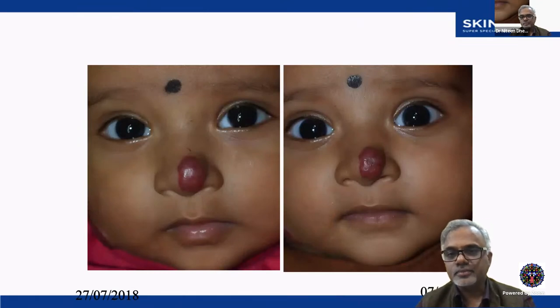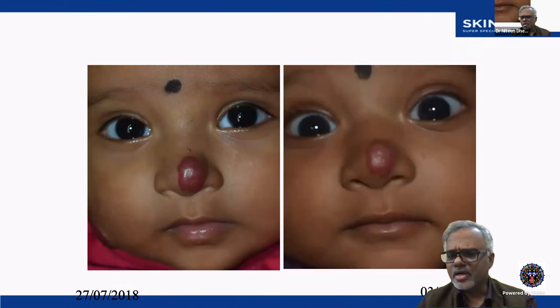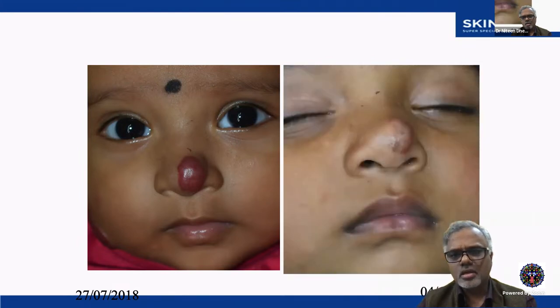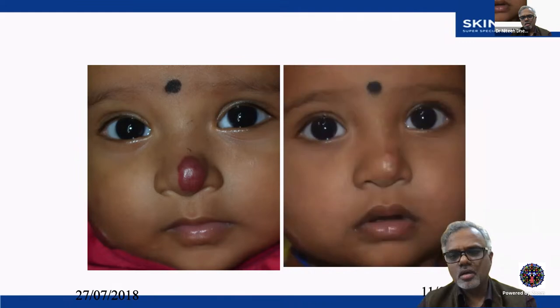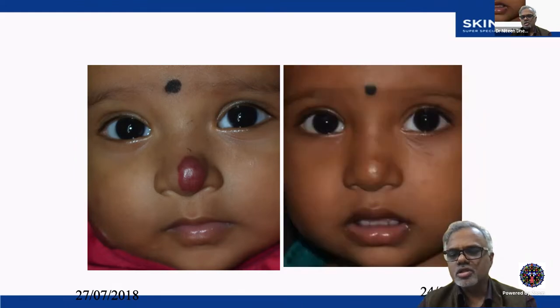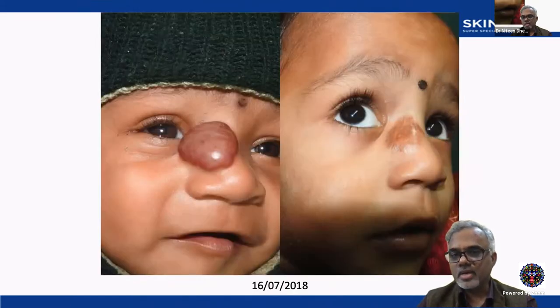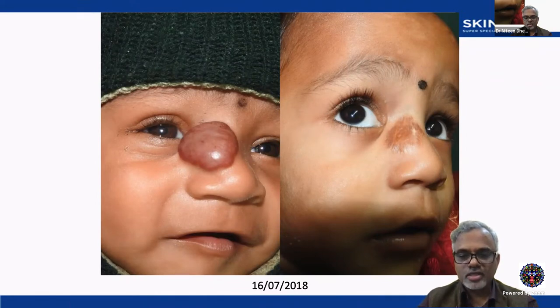Again, another case, a nose hemangioma treated with a limited dose of long pulse Nd:YAG laser, heals. This is the outcome with the laser, no deformity, no scar, nothing, compared with this when there was no vascular laser available. So laser is nothing but a magic when it comes to periorificial birthmarks. So here this nodular hemangioma, before it grew, we could control with the lasers.